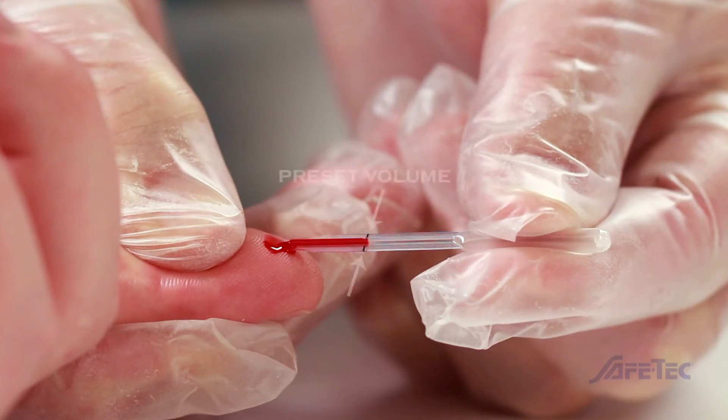Please note that if you do not allow the blood to fill all the way to the indicator line, dispensation will be impossible.